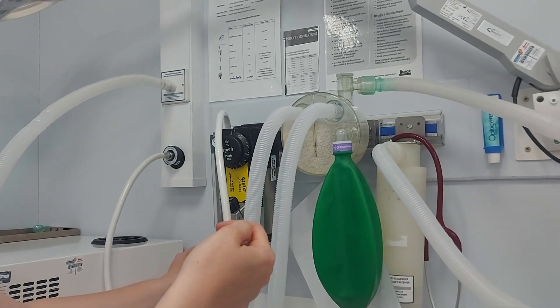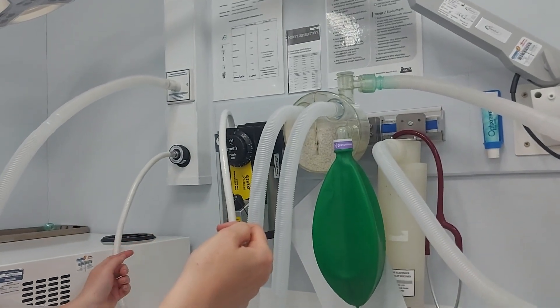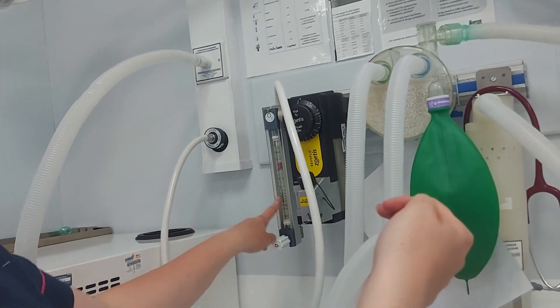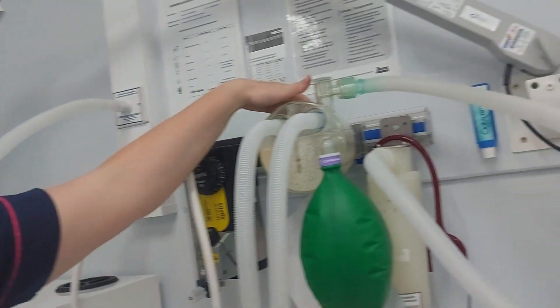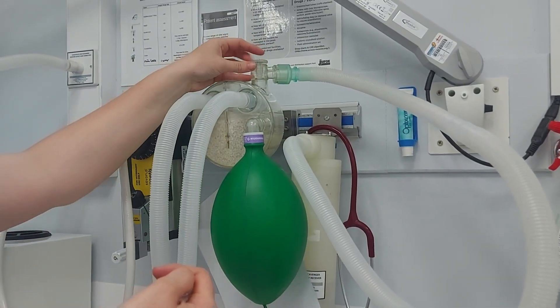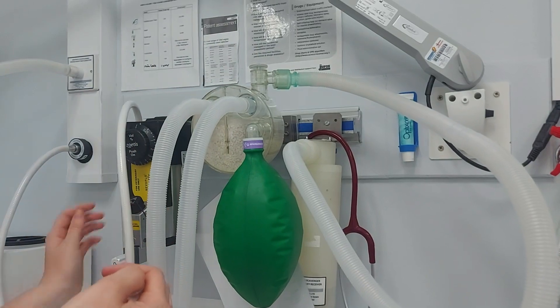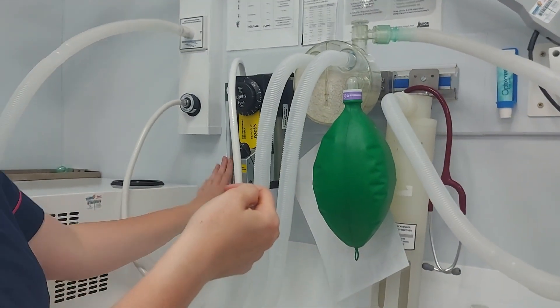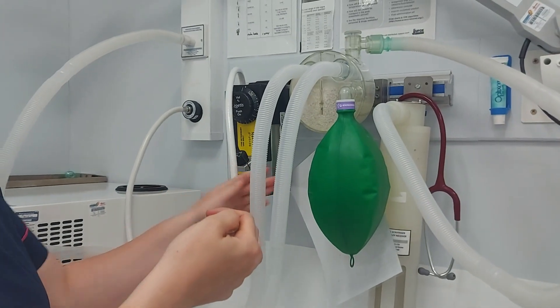We then turn our flow meter up. Checking that this is working — it's a bobbin so it should spin. Checking that this flow meter doesn't drop, and also making sure that the oxygen flush works. Flush that one — I'm happy that it's open and full. So I will open my APL valve first, then turn off my oxygen flow meter. I'm happy that it didn't drop, so there's no leak in the circuit.